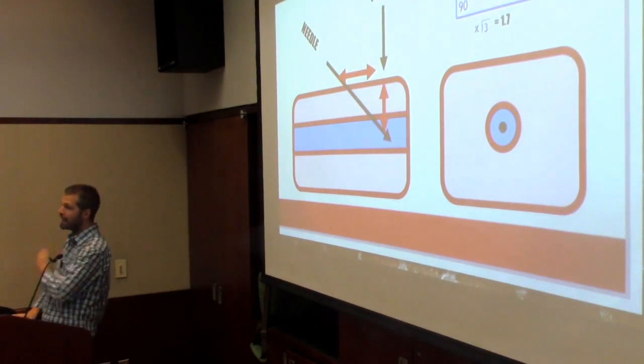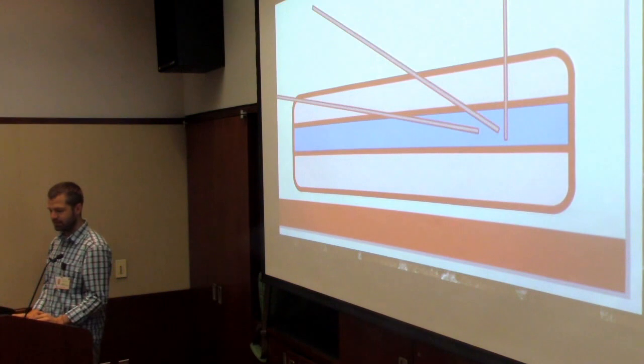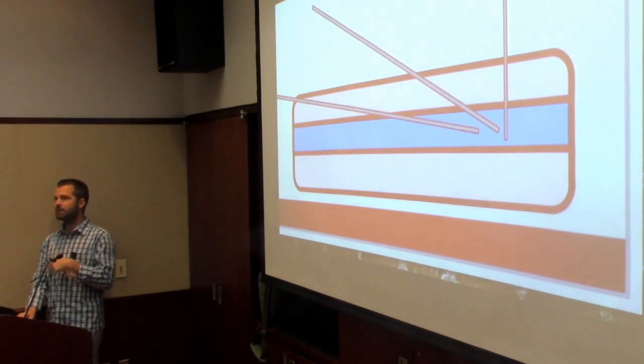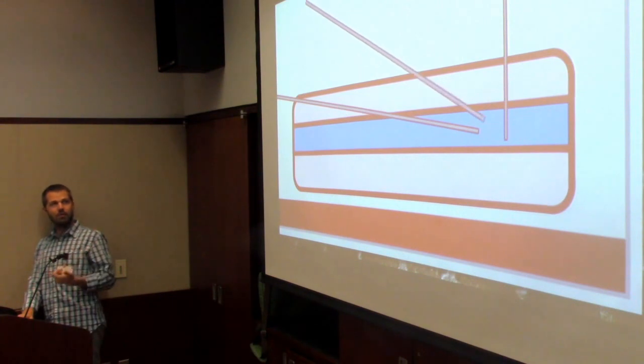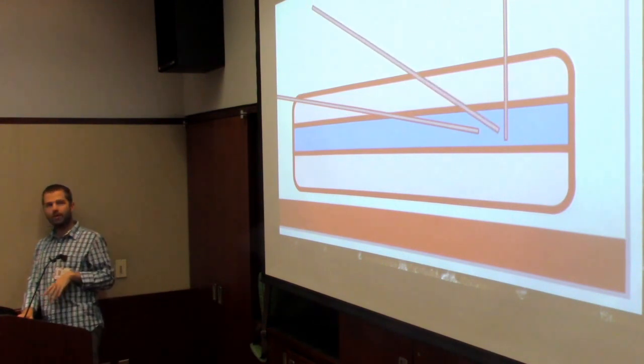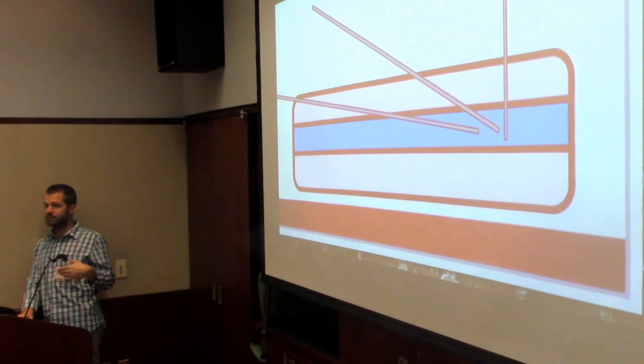And by this procedure, I mean every procedure where you're going to be sticking a needle into somebody. So just think about the pros and cons of all the angles you take. Say we're going at 45-degree angles. We're doing essentially a central line. We're going in at an angle where I can get close to the probe, I can get it in, it's a relatively deep distance, my needle isn't that long necessarily. Say I'm doing an ABG.